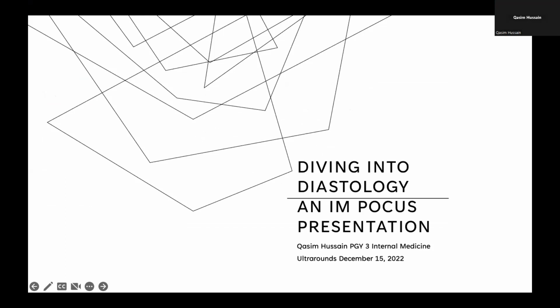So thanks, Jeremy, for doing that part of the presentation. The systolic aspect is very important now that we have a prerequisite set in place. I'll go ahead and start diving into some diastology here from a point of care ultrasound perspective. Just to note at the beginning of the presentation, this is diastology in the context of heart failure with preserved ejection fraction. There's a slightly different algorithm and different diagnostics for reduced EF.